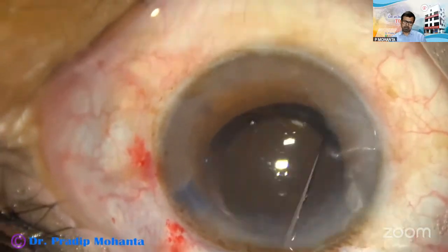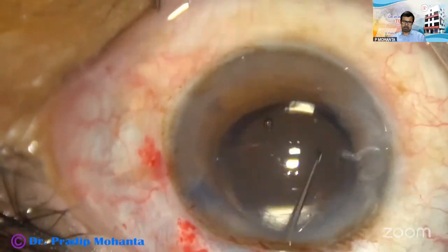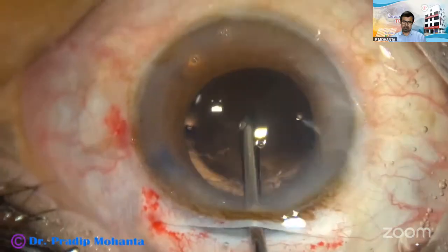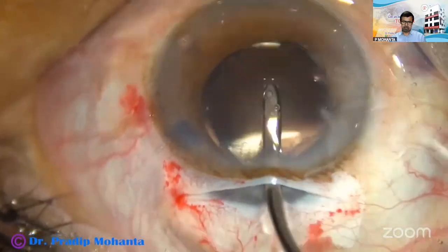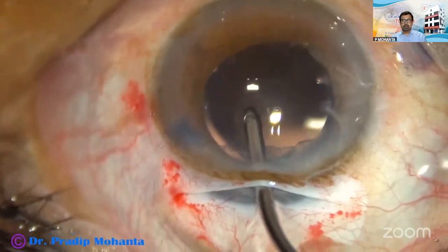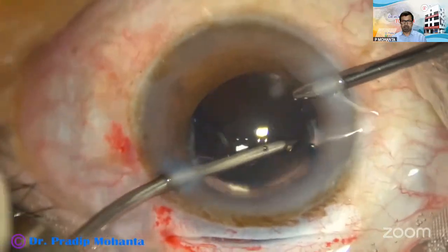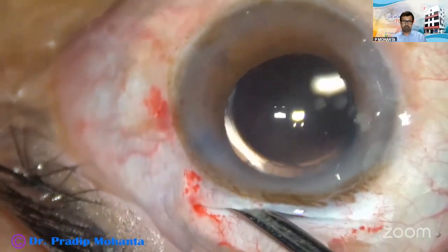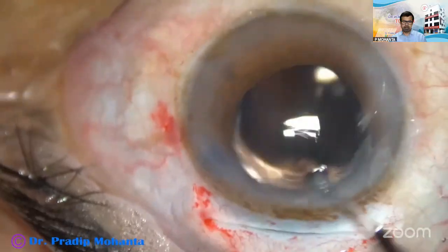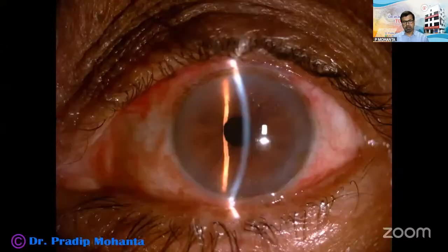The bag is good. There is a good amount of anterior capsular rim, so the haptics are placed behind the anterior capsular rim. There is no PC rent, so the lens settles in the bag nicely. And see the beautiful post-op picture after 24 hours.